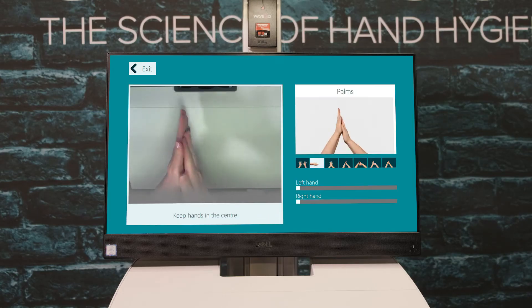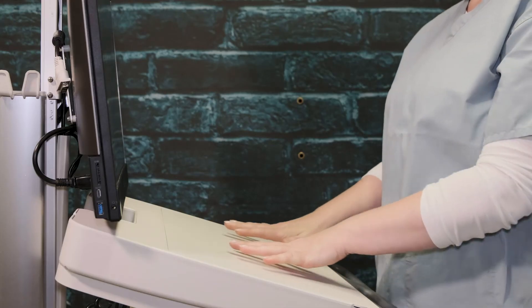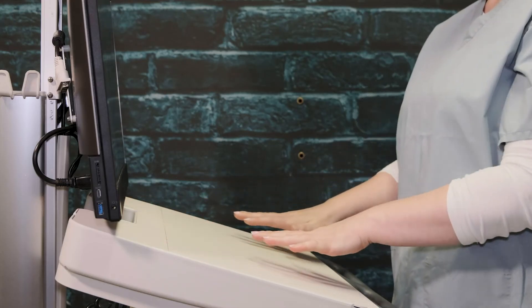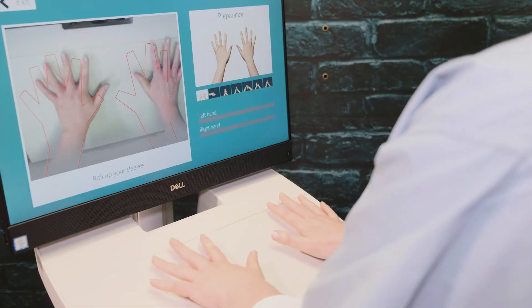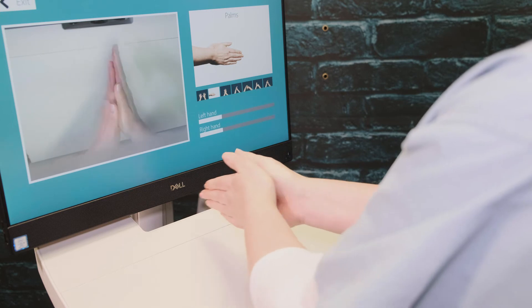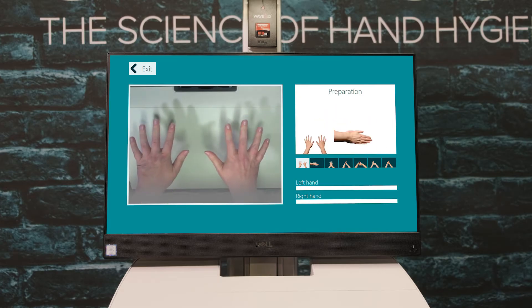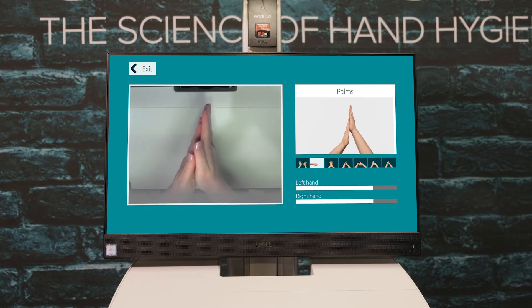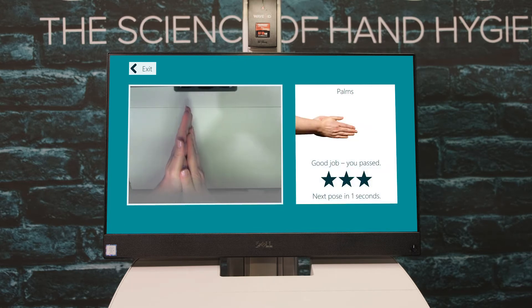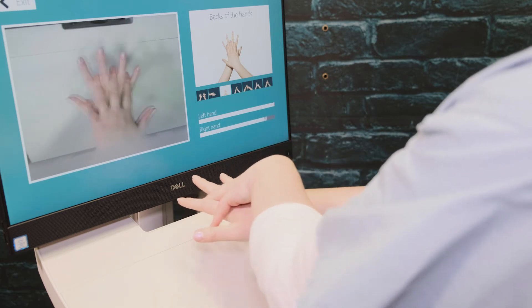Match your hands to the template on screen and follow the instructions. Keep your hands centered and move them up or down to find the right height. You will know that your hands are in the right position when the on-screen template turns from red to green. Now you can begin to perform the different hand hygiene poses on screen. Perform each pose until the progress bars fill up and you can then move on to the next pose. Surewash's real-time analysis means that the progress bars move as quickly as you do.